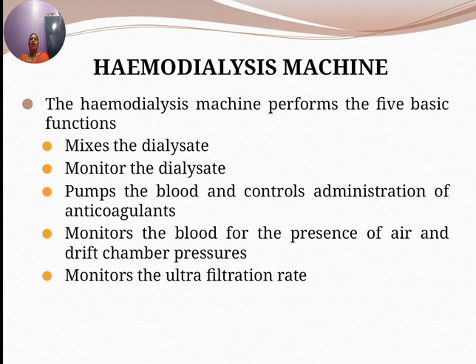Hemodialysis. So we are very particular with hemodialysis. In our topic of discussion, we are going to discuss hemodialysis. The first method, the hemodialysis method. The hemodialysis method is the most common method, as I told you.